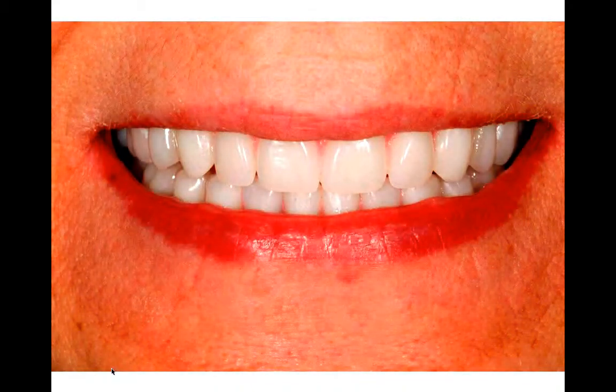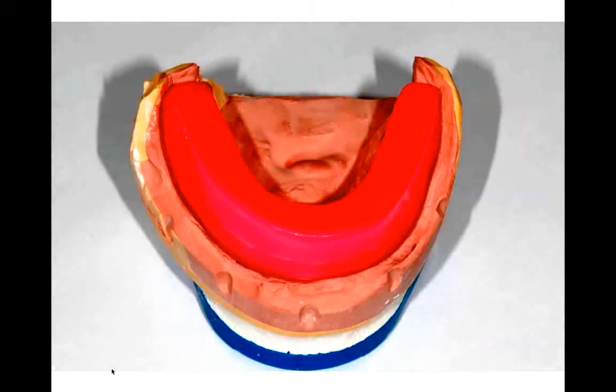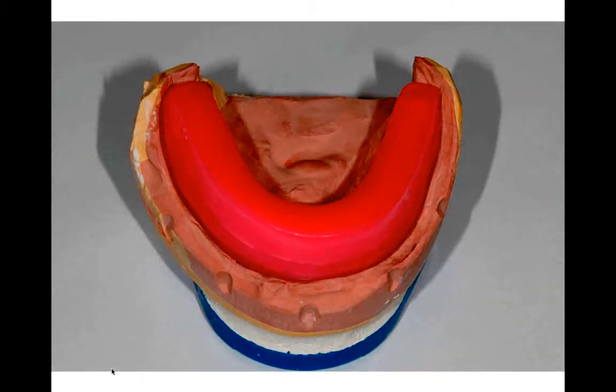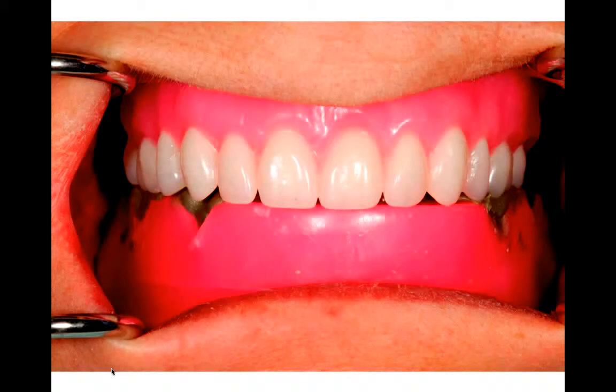So I'm going to run through a complete denture case that we published in Compendium in January 2013. In this case, we're showing the final try-in stage, but in conventional prosthetics, we would make a processed base or a base plate and a wax rim, just kind of like normal. And then we'd go to the mouth and get our bite record.